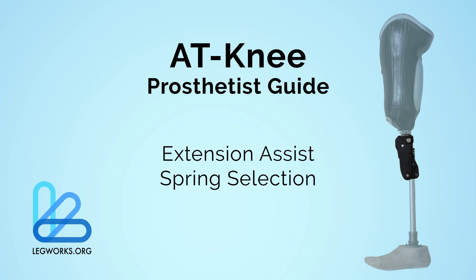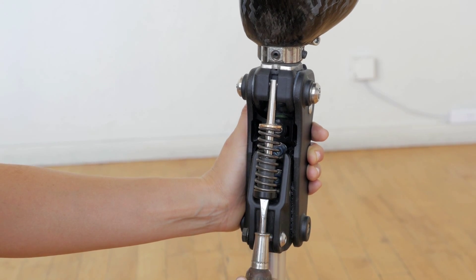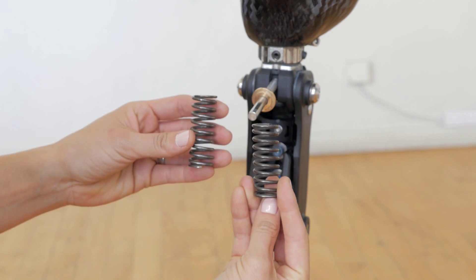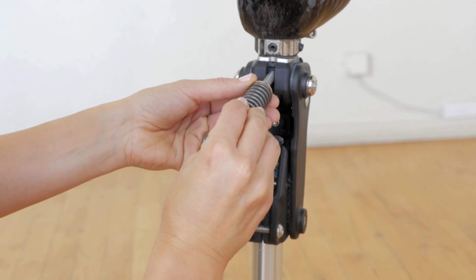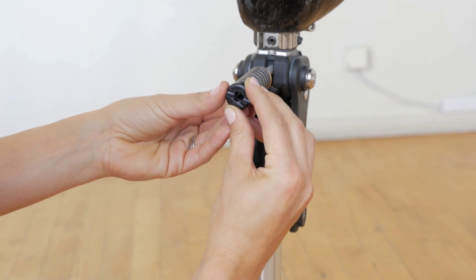Lower activity level patients should use a less stiff extension assist spring. Higher activity level patients should use a stiffer spring to prevent excessive heel rise at faster walking speeds. The spring can be easily popped out by wedging the extension assist base out with a flathead screwdriver. Ensure that the extension assist base is aligned with the bottom shaft when placing the extension spring back in place.